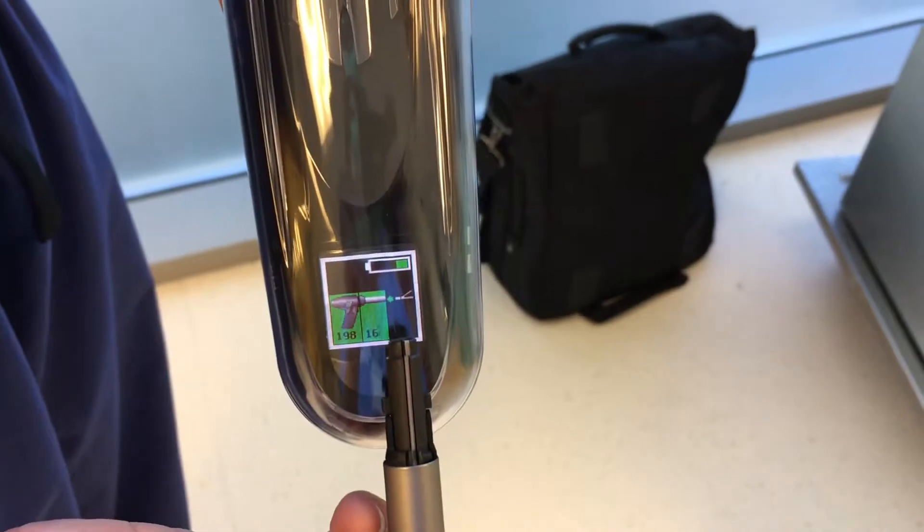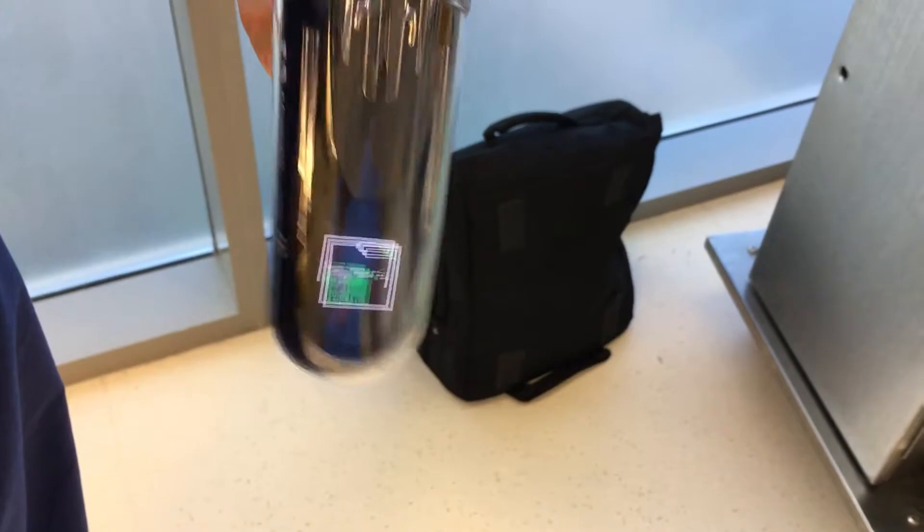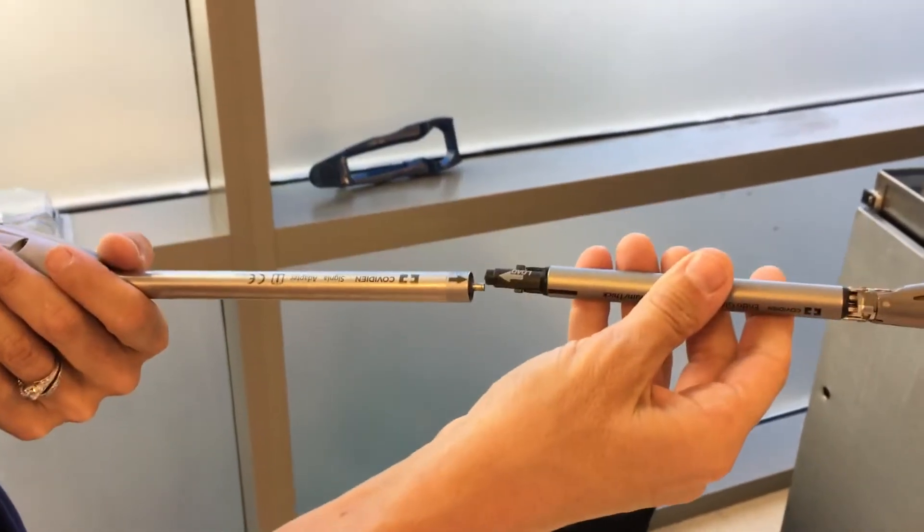The stapler on the LED screen is telling you to put a reload on, so if you need a second firing, you'll put the reload on just as if you were using the manual handle.